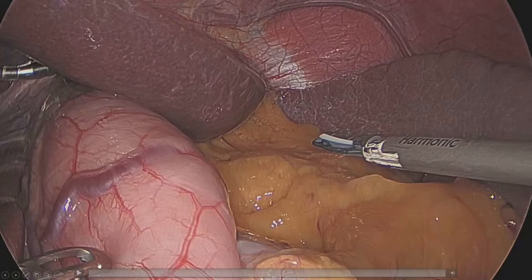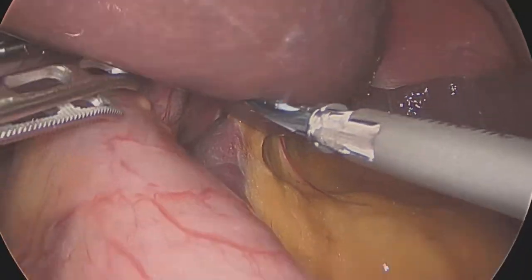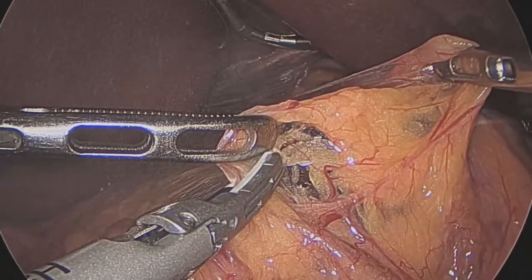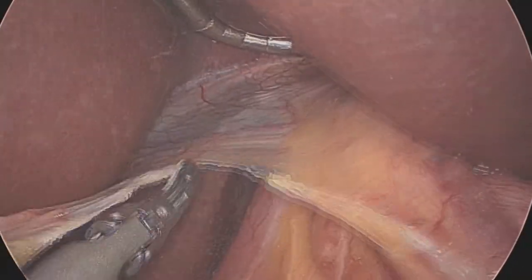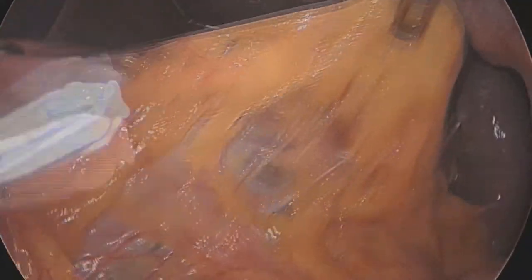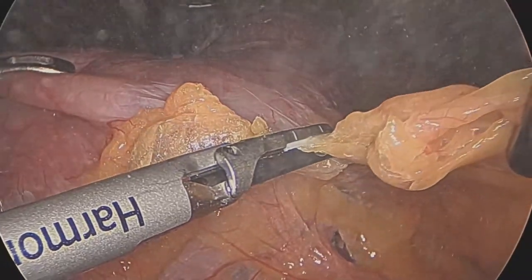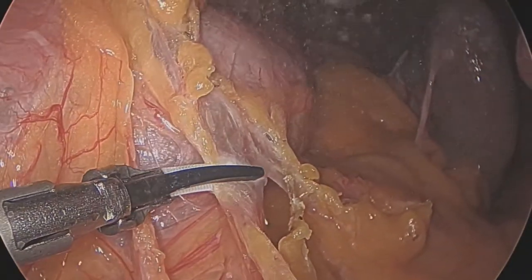This is a short video clip. You can see that at the first surgery, there was no gastric pouch dilatation, and the sleeve shape was a little bit dilated, but it looks great. If the patient's pre-op endoscopy and upper CT scan show some hiatal hernia or intrathoracic migration, you have to expose the crus muscle, dissect up to the mediastinum, pull down the gastric pouch, and then close the crus muscle as needed.